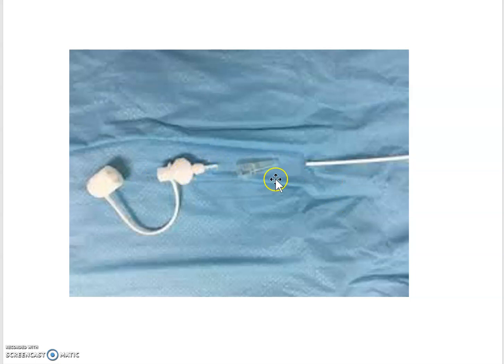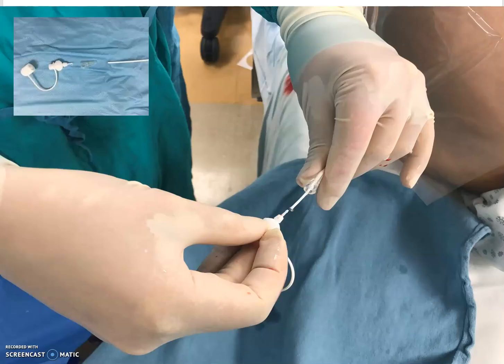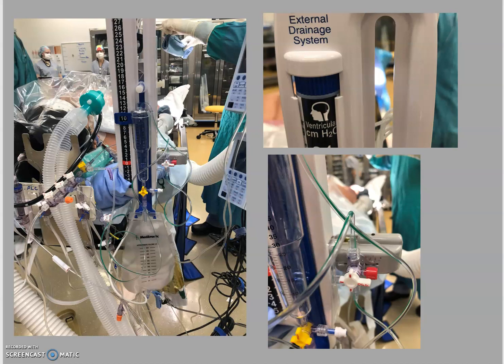Again, you have the little cone piece that goes over your spinal catheter. The cone piece slips over the spinal drain, then you hook up the little white connector — the proximal part of the spinal drain gets pushed back, the cone piece gets pushed back on top of that, and then you do a little tie around it to connect it. After that, hook up to the spinal drain setup.